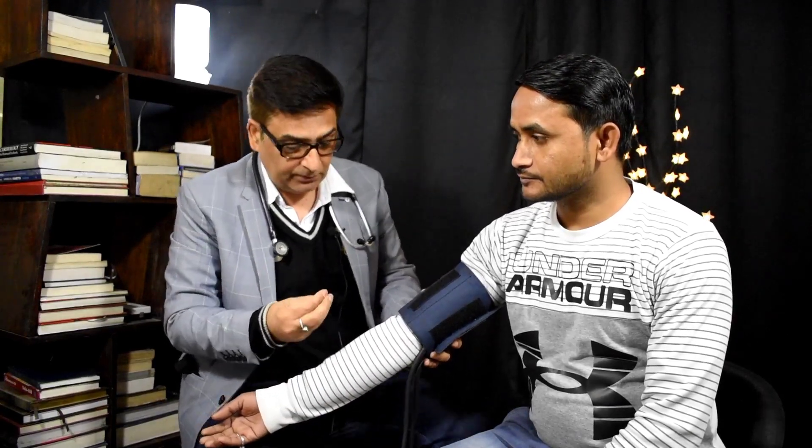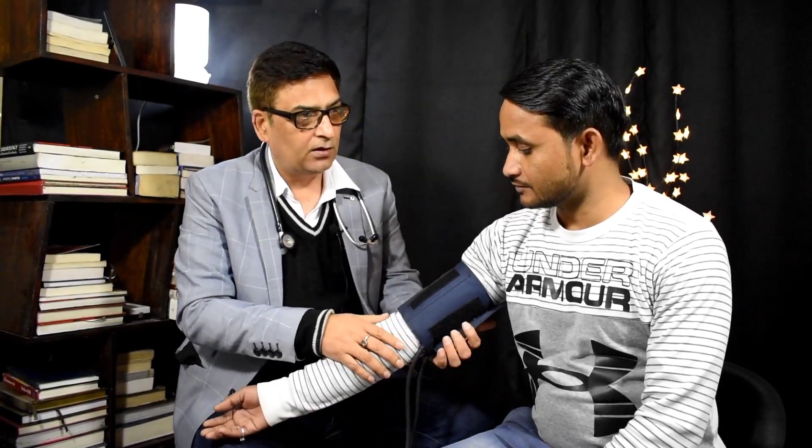Chinese companies ka BP machine — free mein bhi mile toh mat lo. Jo BP machine 500-400 rupaye mein online milti hai, woh BP itna badha deti hai ki aapne jo paanch hazaar bachaye, usse aapke hazaron rupaye lag jaayenge ek hi din mein — seedha hospital mein bharti ho jaoge. Yeh chhota sa demo tha ki sahi tarike se BP check karne ka method kya hai.